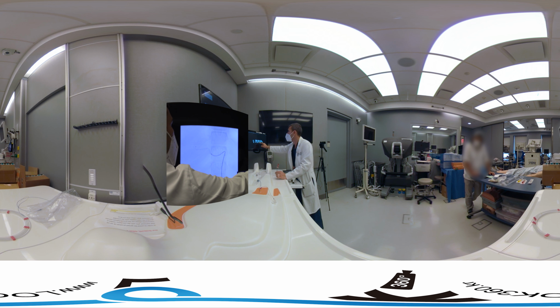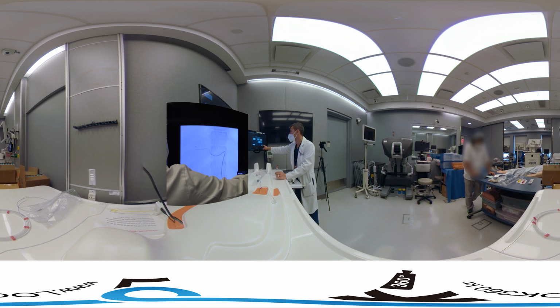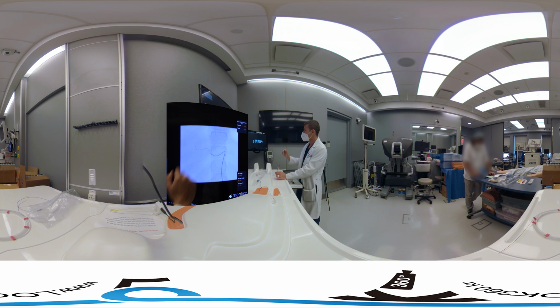The other option, which we're going to do here on the Mentis, is that we're going to select drug-eluting particles. And the size we're going to choose are 100 to 300s, and we're going to suspend those again with doxorubicin. So we selected those embolization particles, and now we're going to deliver them.